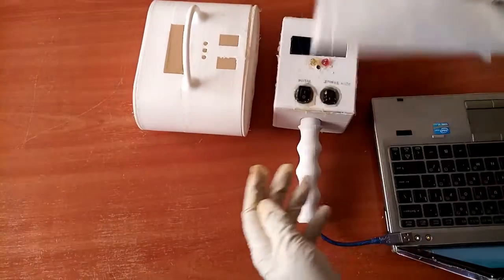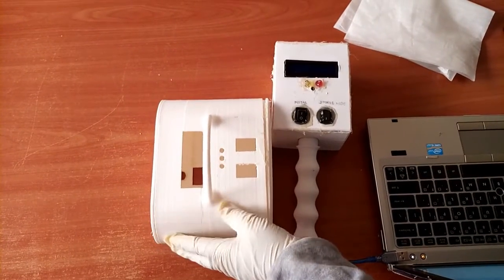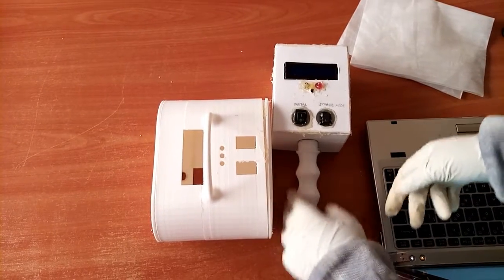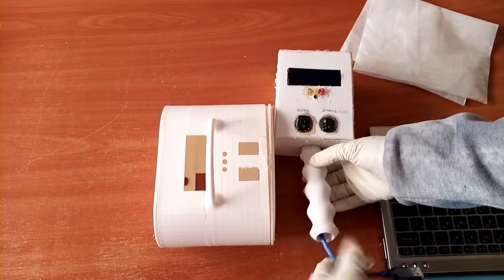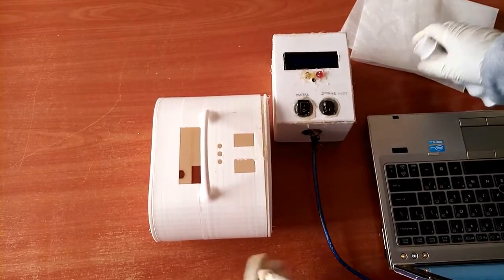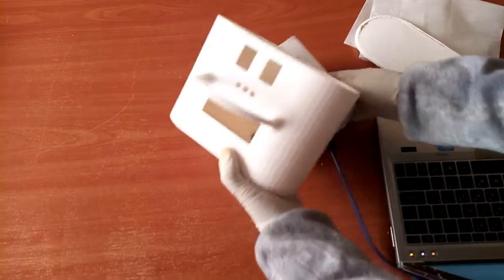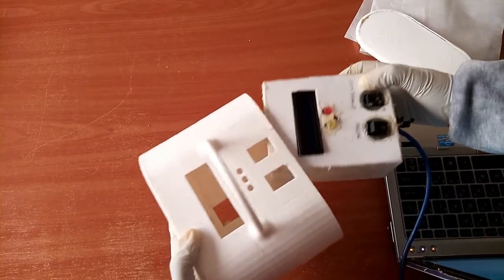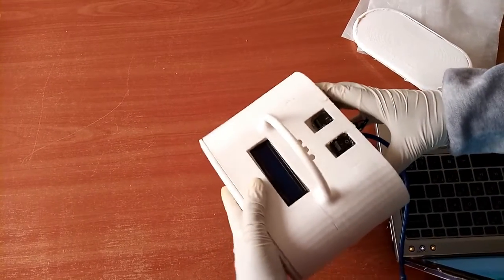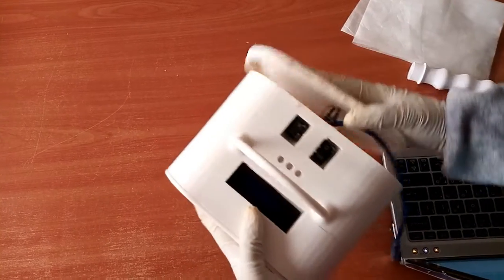Now here we have the other alternative, the outer casing. That means both the inner casing and the outer casing will be used. In this case, we won't need this handle. So it's easy to put it in. You just take your device and place it in the outer casing. This will help because the outer casing will be the one which will be sterilized. After every procedure, the outer casing will be sterilized.